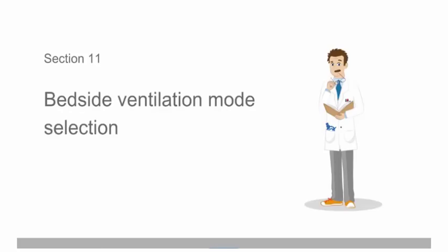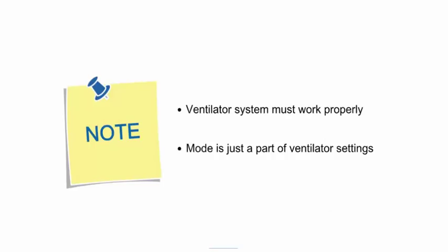Bedside ventilation mode selection. Every mode has its indications and contraindications. There is no bad mode, but improperly used mode. This section provides some useful tips on mode selection. Before talking about mode selection, keep in mind, talking about mode selection is meaningless if the ventilator system is not functioning properly. Optimal mechanical ventilation requires not only proper mode, but also other ventilator settings.